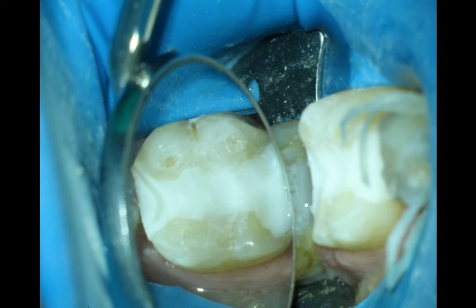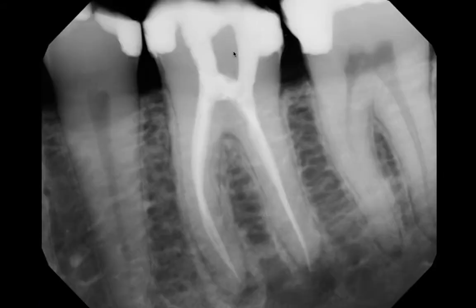We can flow the buildup underneath this truss of dentin to the distal and cure that. This is the way the buildup looks, and this is the way the patient leaves when we've done a truss access. You can see how this ties the buccal and lingual of that tooth together — and we know that's where we put our most force when we're chewing or when we have parafunctional habits.